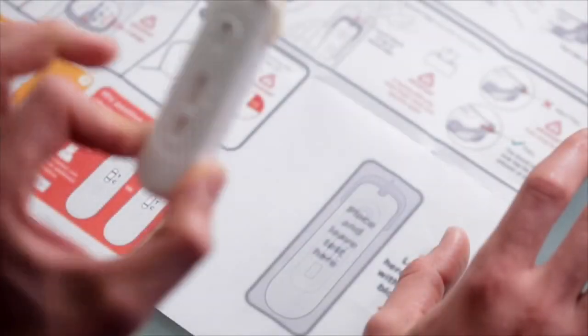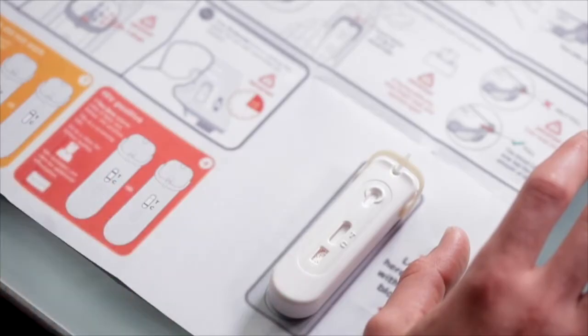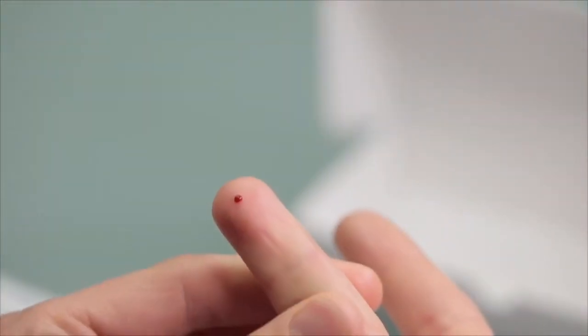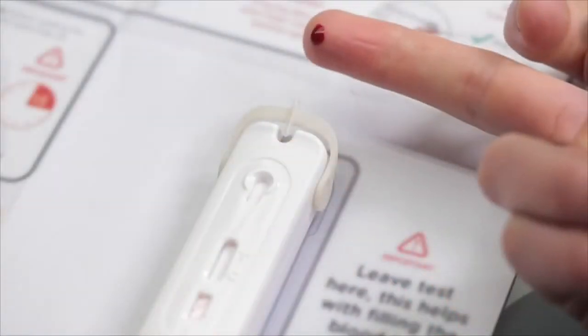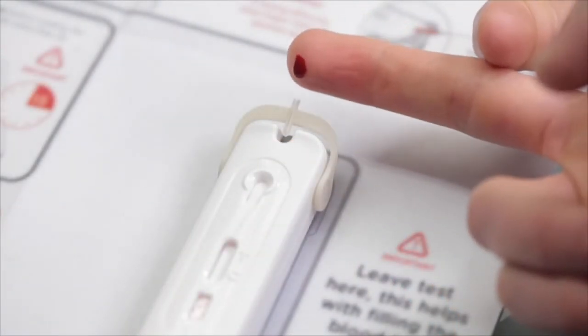Now place the test down on the instructions in the bottom right corner. This will make it easier to fill the tube with blood. Squeeze firmly behind the prick site. For the next step, you should not pick up the test. It should stay on the table.